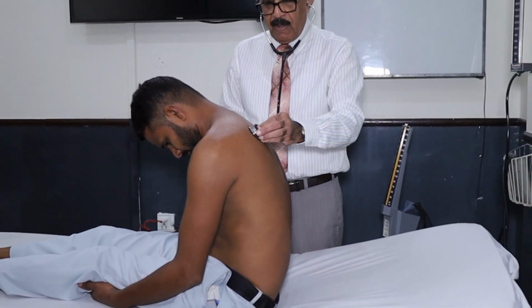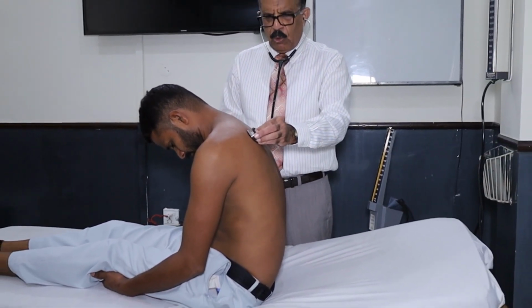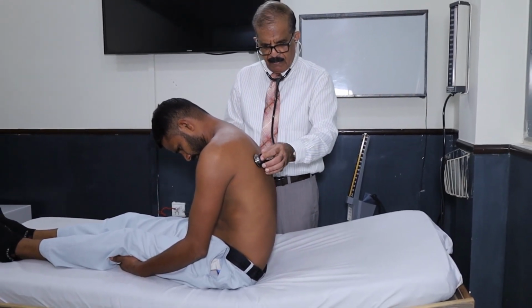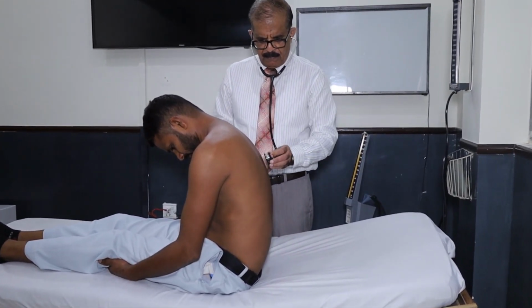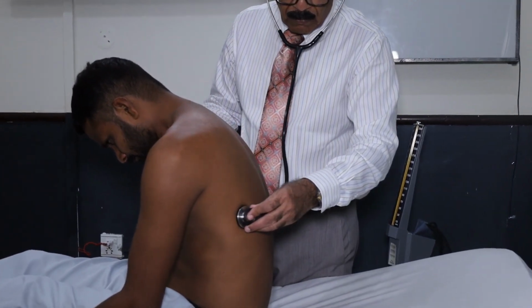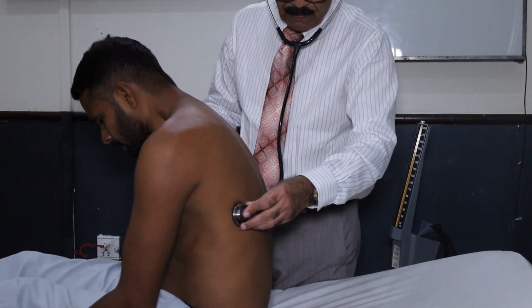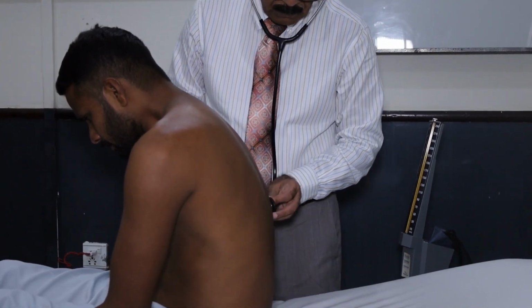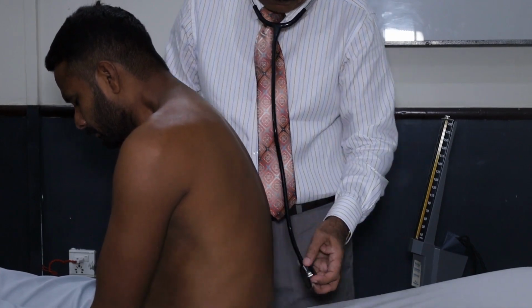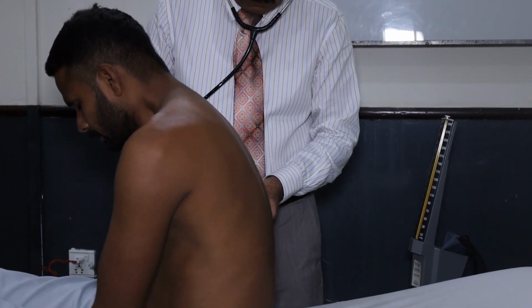Every intercostal space should be auscultated so that you don't miss any finding. Deep breath. Right, good.